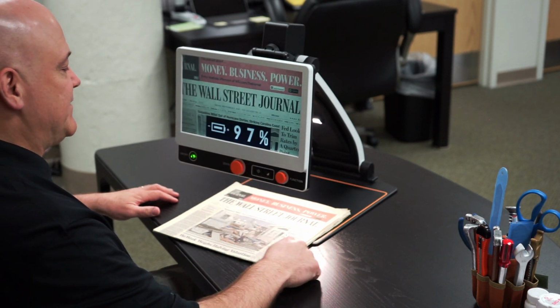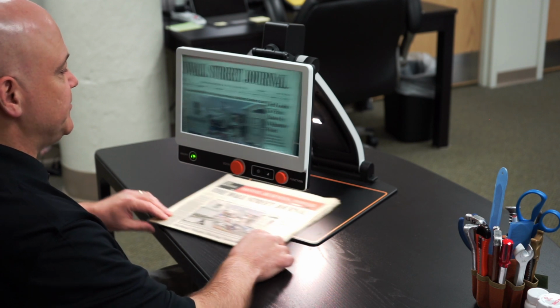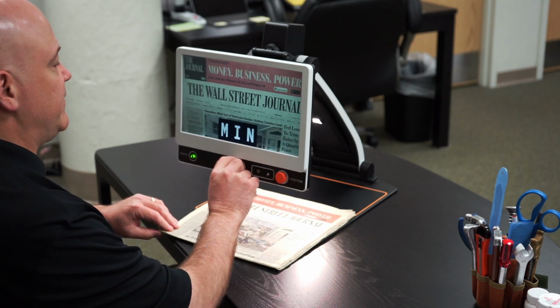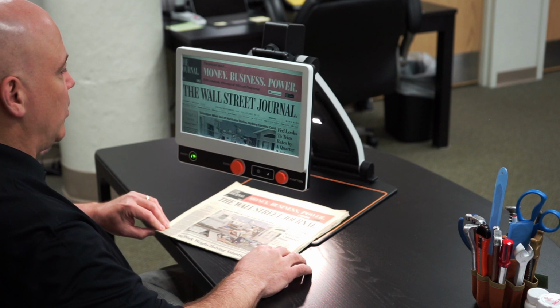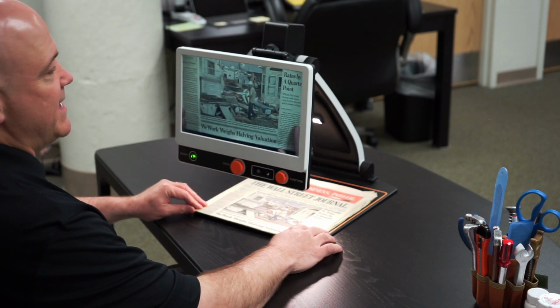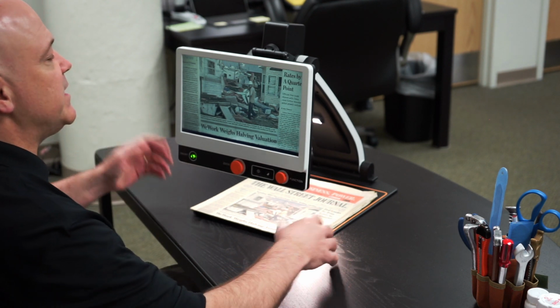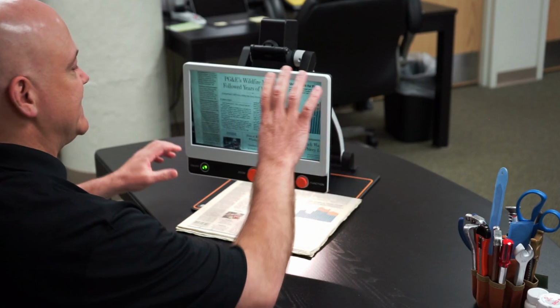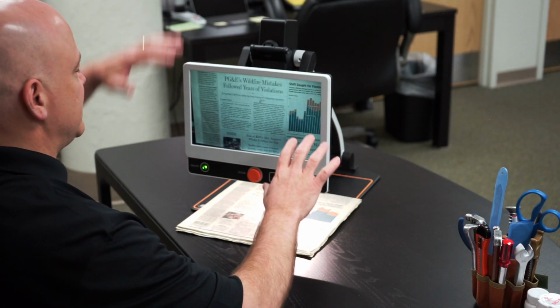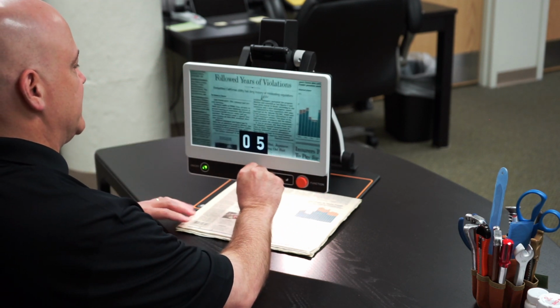It tells you the battery life is 97%, and we're at a zoom level of like 19, I think it was. A really nice field of view, so you're almost getting the whole paper from left to right on screen. You're never going to read it at that size, but it's good to get a sense of perspective of where you want to go. Let's just say I wanted to read this article right here. I can tell there's graphics there. There's a sideline of the paper here with an outline, but I'm going to read this article. That's the one that's important to me.